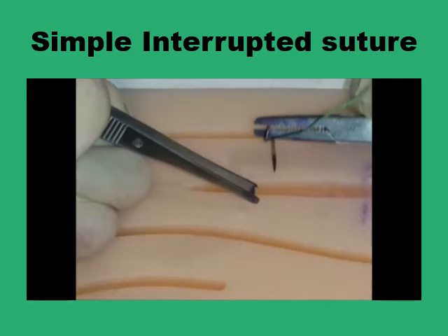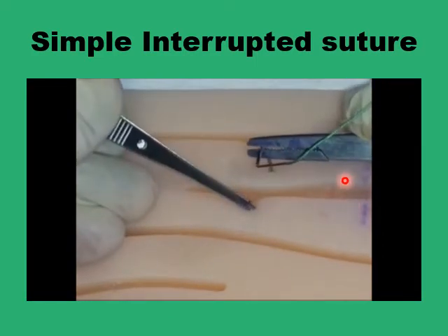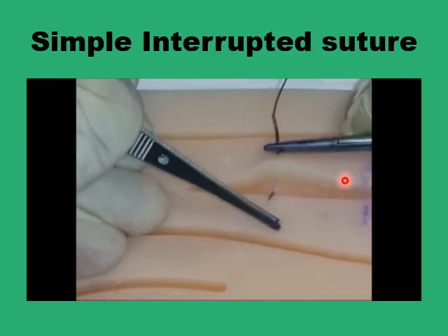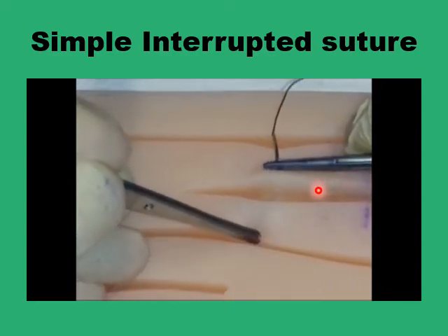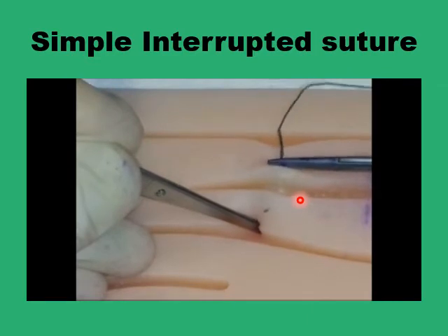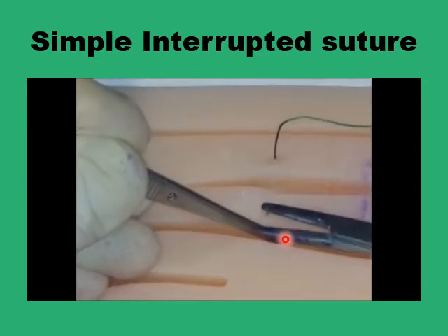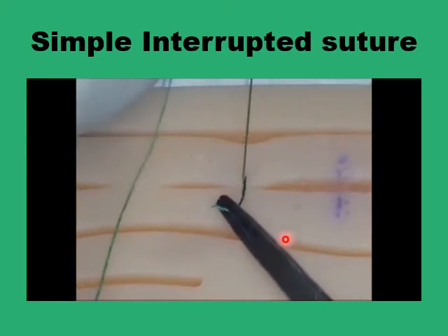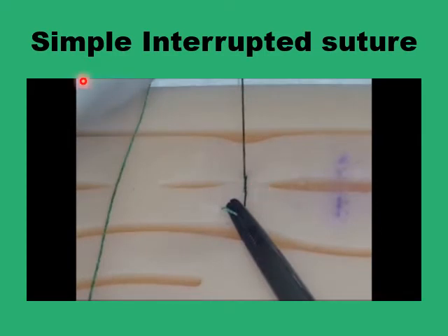The simplest way of producing wound edge eversion is to use the common simple interrupted suture. The way to do that is to press a little bit with the closed jaws of a toothed or non-toothed forceps just behind the point of entrance into the wound edge. You can see clearly the dermal layer, the epidermal layer, and the subcutaneous tissue layer. Do the same on the other side, press with the closed jaws of the forceps, retrieve the needle, and tie the simple interrupted suture to produce the required skin edge eversion.